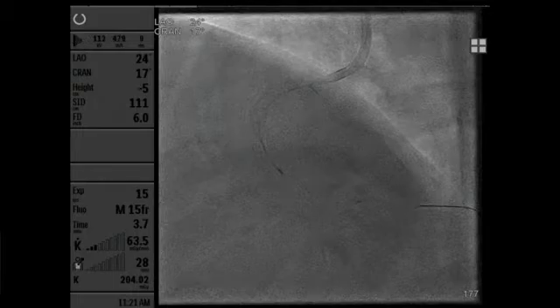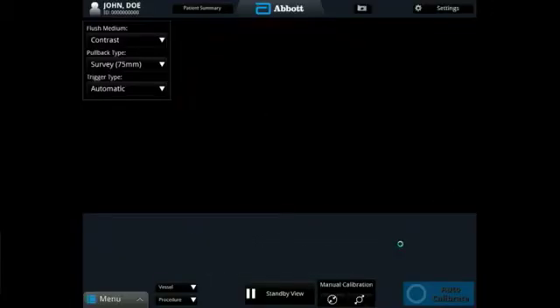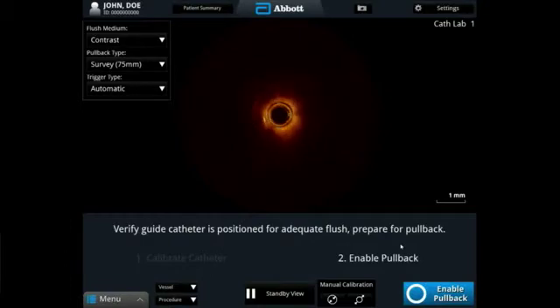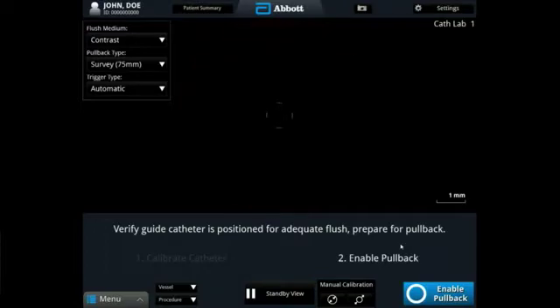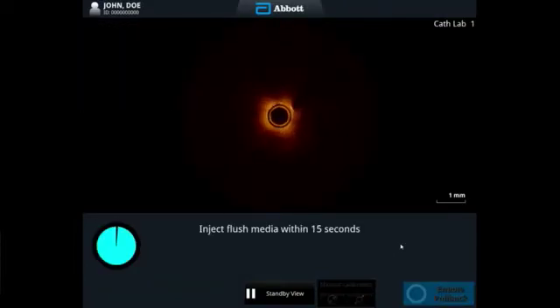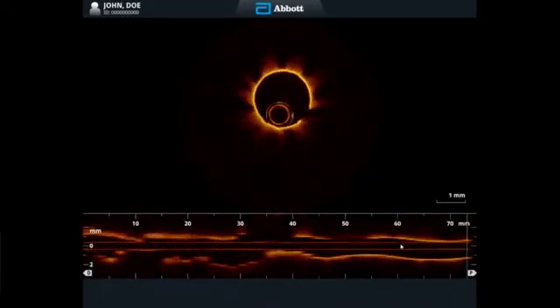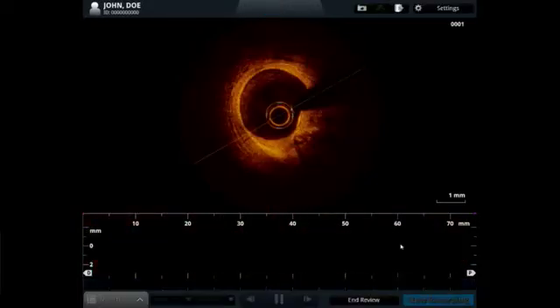Yeah, can you bring up OCT now? Here we go. We're ready. See it? Excellent. Try to calibrate. To start with, Ron, are the images better now? Yeah, much better. Not jerky. Okay, thank you. It's definitely nice now. You can also see side by side, but we should focus on the OCT now. Yeah. Very nice. Good pullback.